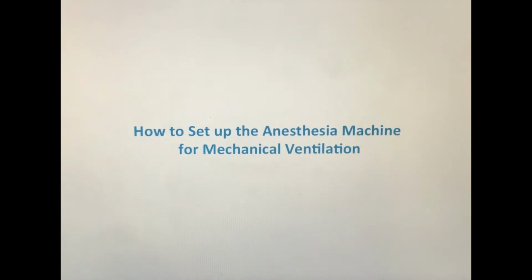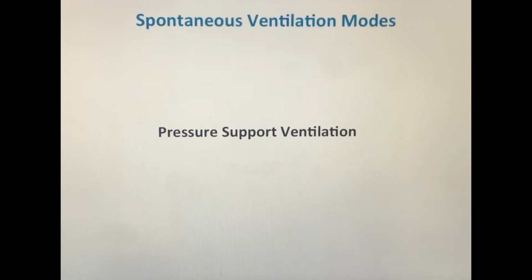In this lecture, we're going to go over how to set the anesthesia machine up for different modes of ventilation. Let's first start off with spontaneous ventilation modes. The first that we will go over is pressure support ventilation.